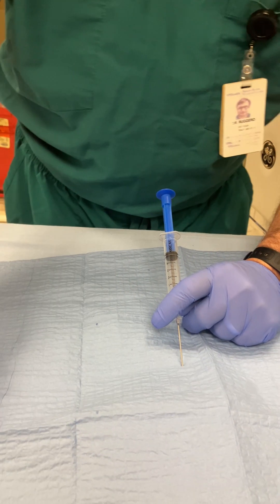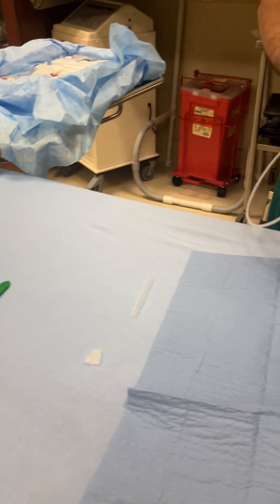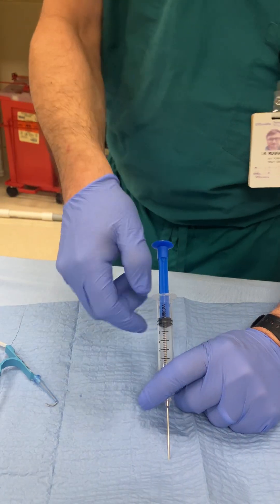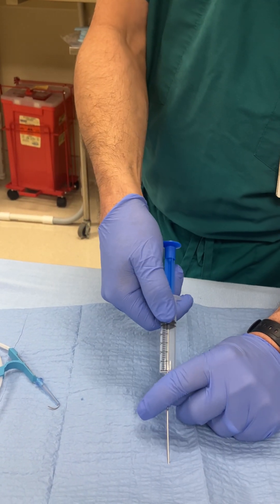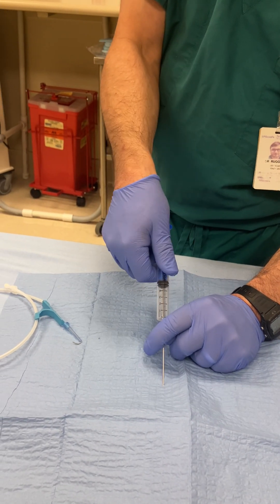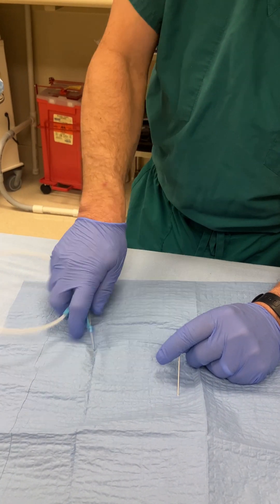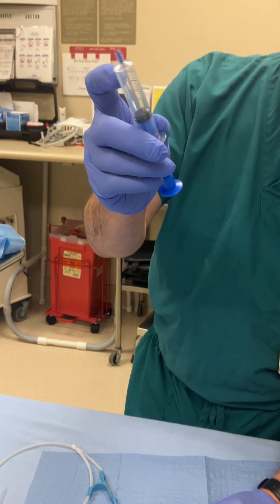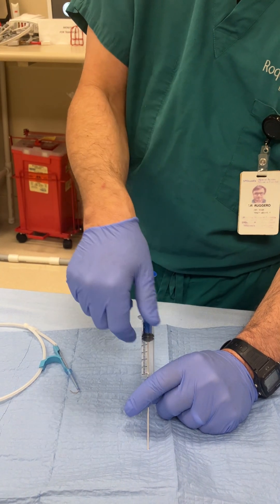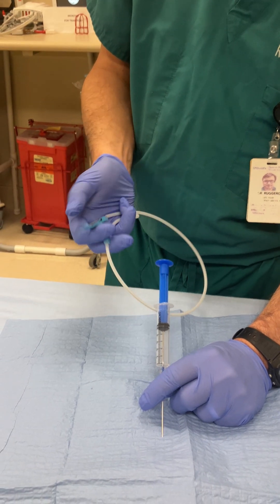I'll remove the cap from the wire, pull back, and advance the wire through the syringe. Another option, if you don't have a syringe with this push-through mechanism, is to brace your hand with the ulnar aspect on the patient's body so you're not moving the needle, disconnect the syringe, and advance directly. The innovation behind this design is that you don't have to worry about accidentally losing the needle tip in the vein by having to separate the syringe.